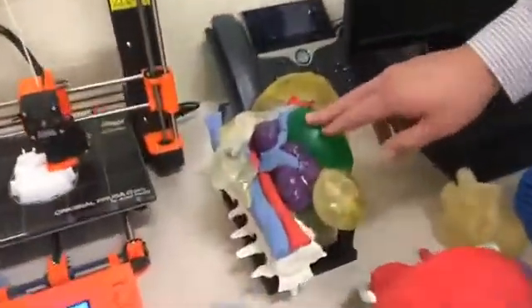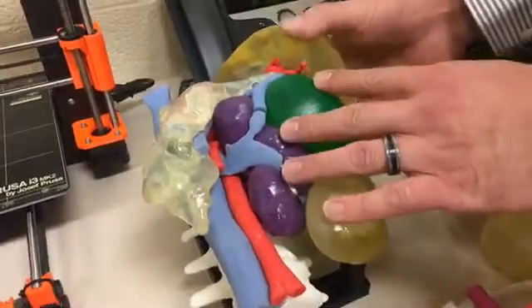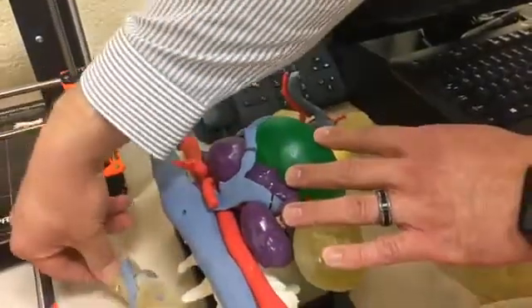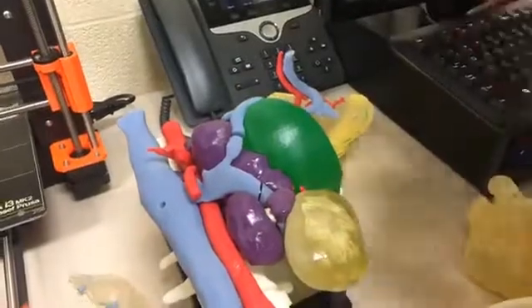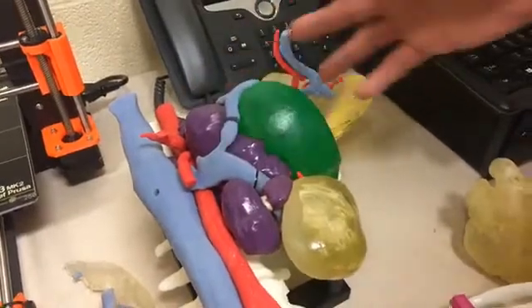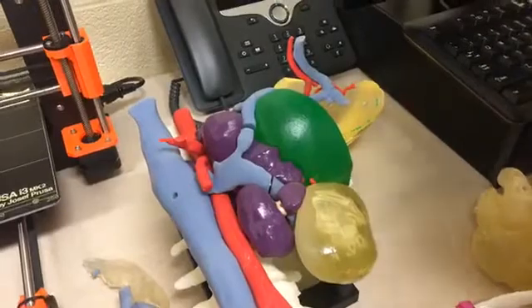So this is the green part, and we can actually tell a child, hey, we're going to take this part out. We build these so that we can pull them apart and show the different pieces that are going to have to be moved. And then basically you've got the tumor there. So a child will put down that iPad, look at this, and understand, okay, here's what we're going to get out. We have to get it out away from all these vessels. For kids, it's good to have a little bit of understanding, but parents really get what's going on.